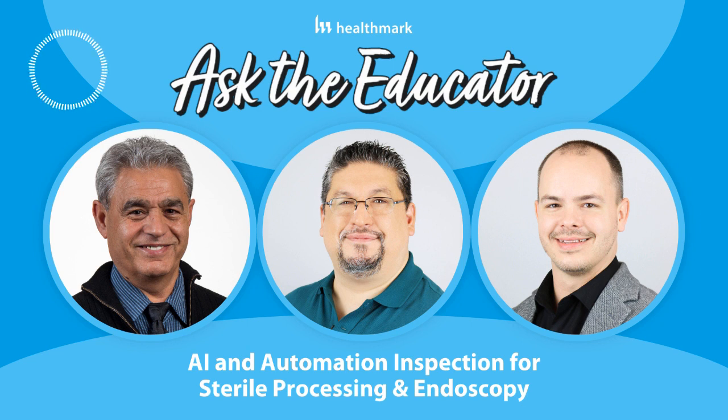We were in one particular hospital. The interesting part was that the endo was obviously clean and processed the endoscope, but clinical or biomedical engineering were the ones responsible for sending these endoscopes for repair. So the manager at the hospital said that SPD should not worry about the reports, send all those to biomed, and they're the ones that make the decision.